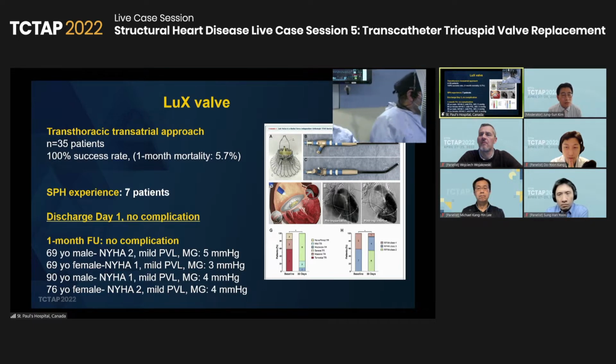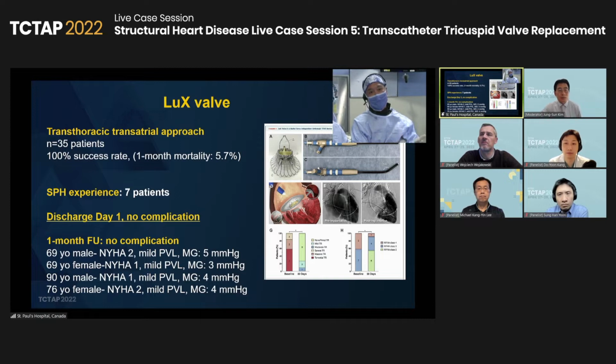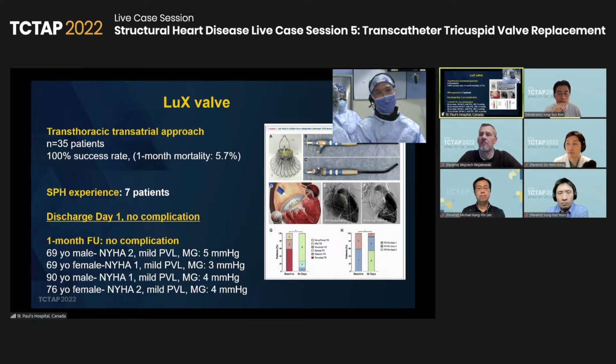Yeah, and I just want to mention that in all these cases we go through a heart team process with a multidisciplinary team approach. We assess the patient, of course, for surgery, medical therapy, the commercially available TriClip, or putting the patient into our trial, the Illuminate trial. And then the 3 devices we have on the shelf, to find the best possible treatment for a particular patient.